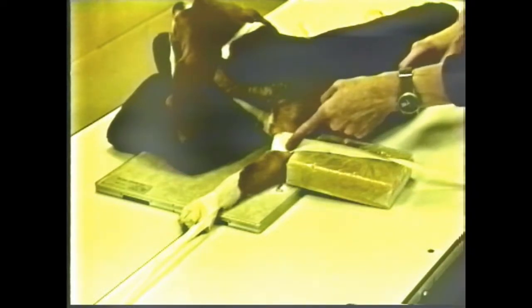The marker is placed on the cassette, and care needs to be taken so that the marker is not over the identification blocker. The more extension the leg has at the time of exposure allows a better visualization of the joint spaces. A properly positioned craniocaudal elbow joint shows the ulna centered over the distal condylar area of the humerus.